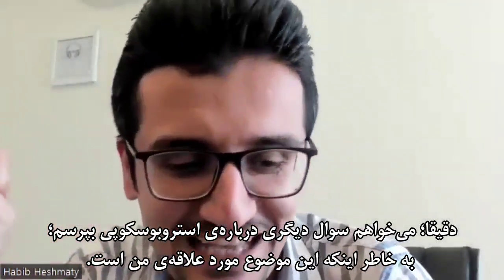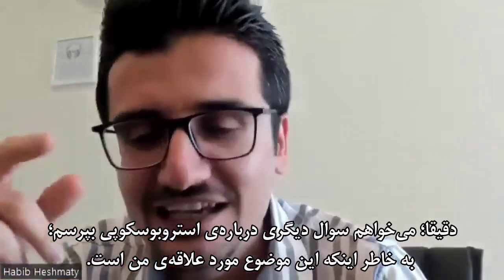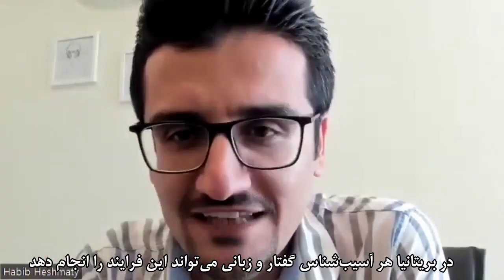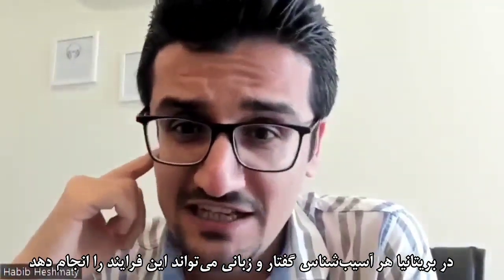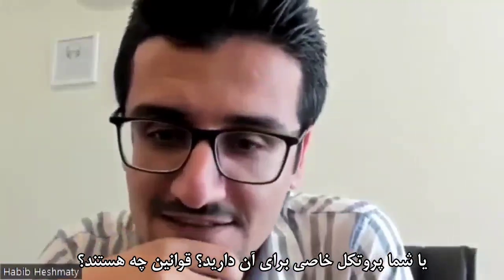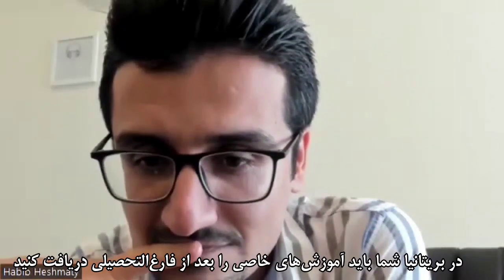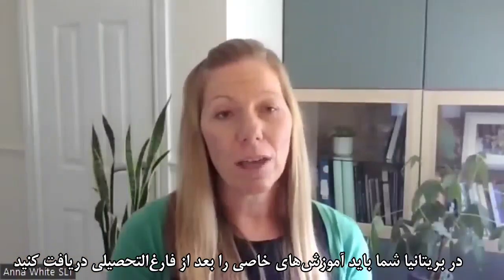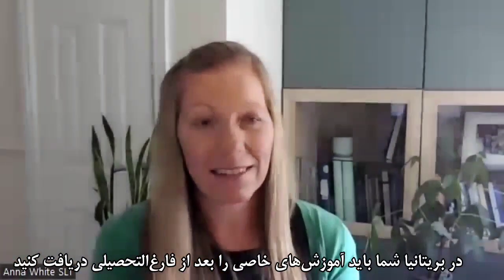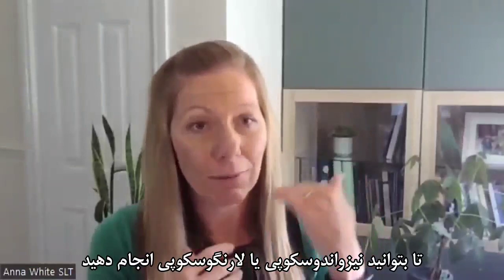I want to ask another question about stroboscopy because it's my favorite topic. In Britain, can every SLP do the procedure, or do you have a protocol for doing stroboscopy for SLPs? What are the rules? So in the UK, you have to undergo training after you've graduated to be able to carry out nasendoscopy or laryngoscopy.